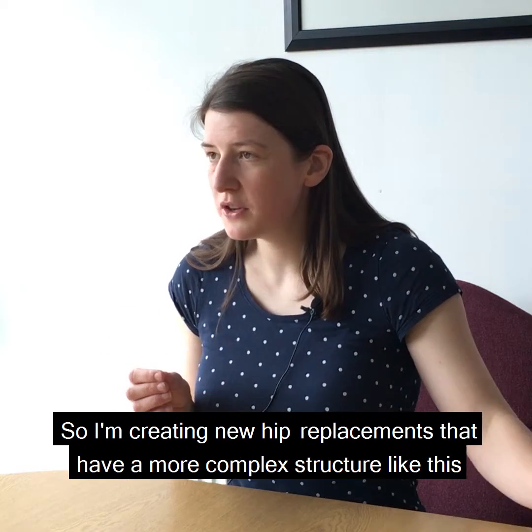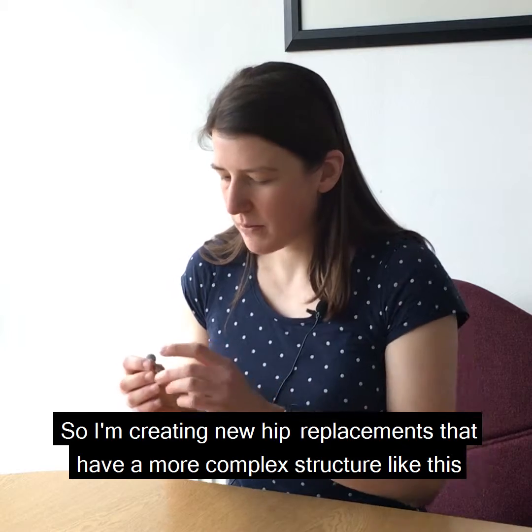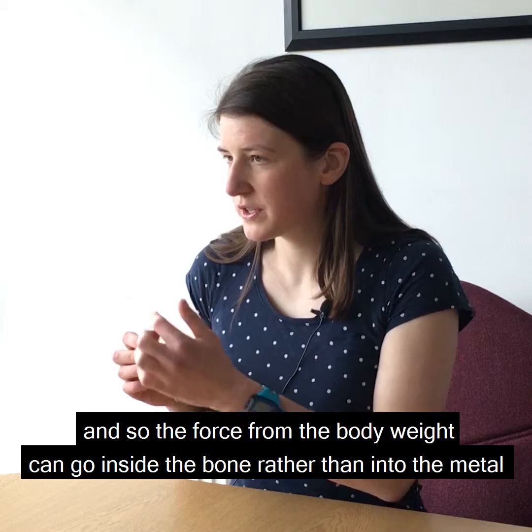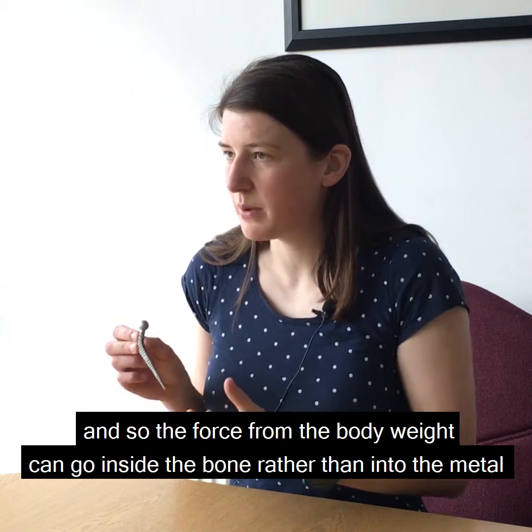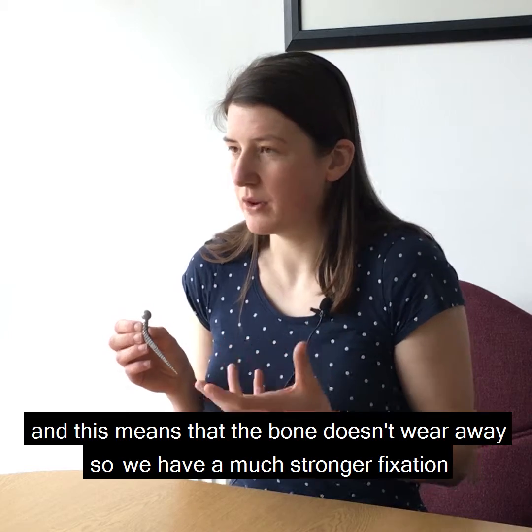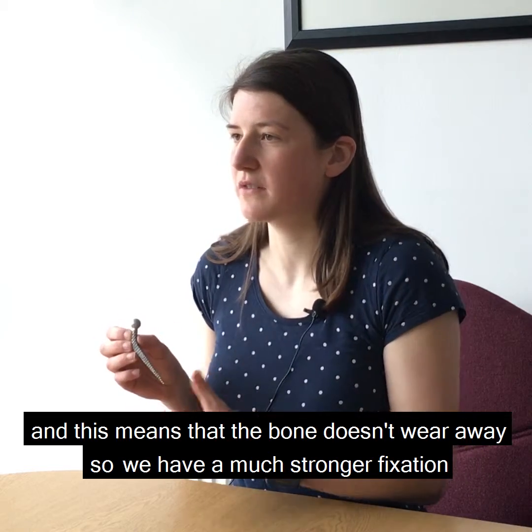So I'm creating new hip replacements that have a more complex structure like this. The bone can grow inside the structure so the force from the body weight can go into the bone rather than into the metal, which means the bone doesn't wear away. So we have a much stronger fixation.